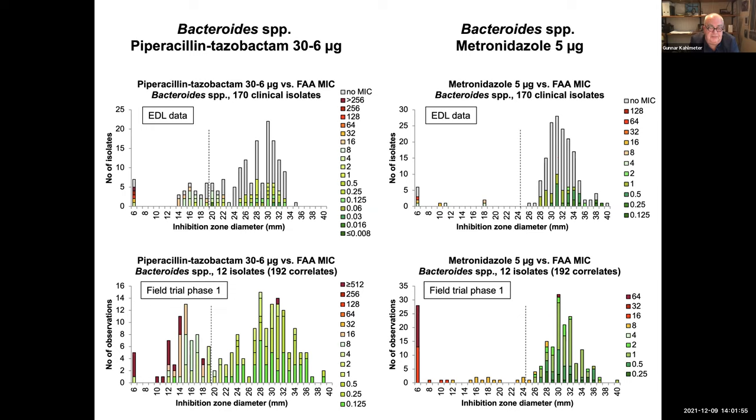There are now two questions in the chat. Yes. So the first one was actually, if sensitive, meaning I think that if there is no beta-lactamase or anything else, can we use the benzyl penicillin disc result to infer sensitivity to Coamox and Piptazo and Mero? And the answer to that, I've already included there, and I've said most probably, but it's one of those things that we're now looking at. So I will not promise that at this point in time. We want to look into it, but I wouldn't be surprised if that would be the end result of things.